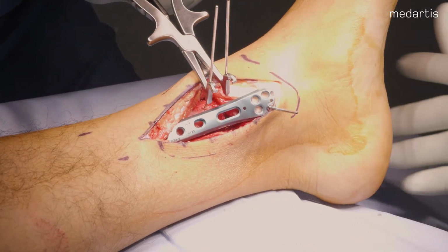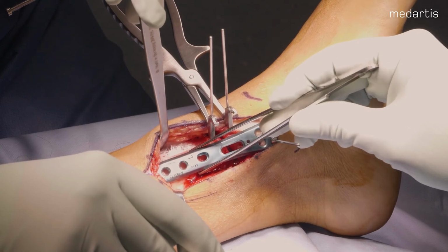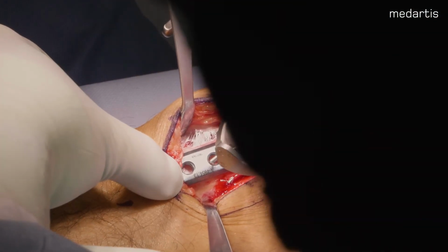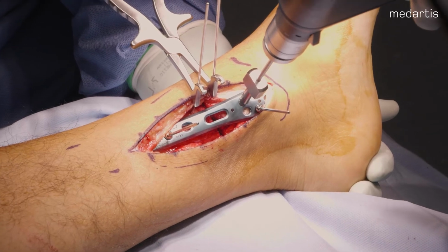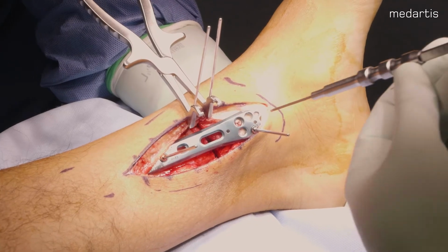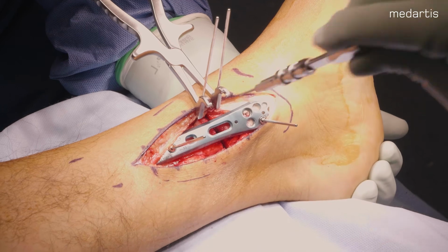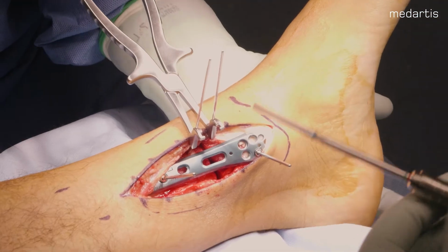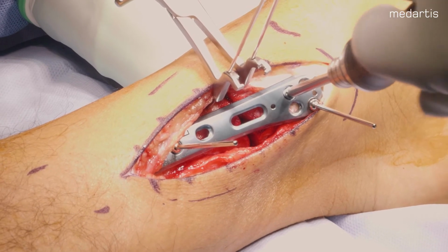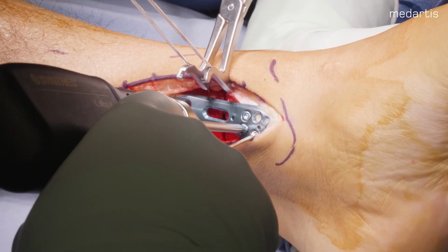The plate is centralized on the shaft and a second olive K-wire is inserted to provisionally fix the plate proximally. Locking drill guides are used to drill all the distal locking screws, which are measured and then inserted under power. The final TriLock locking is performed by hand. The most distal 3.5 screws are drilled unicortically.